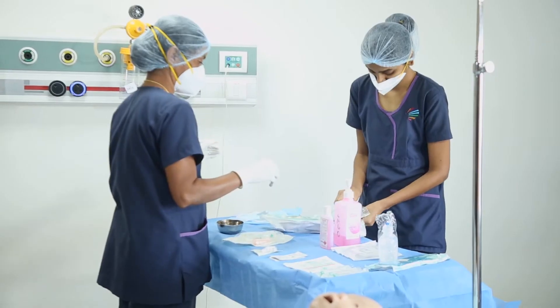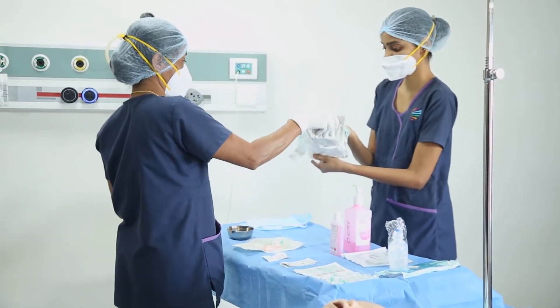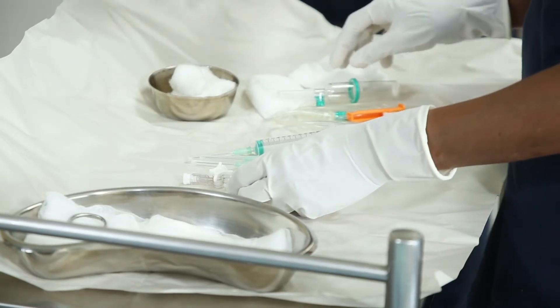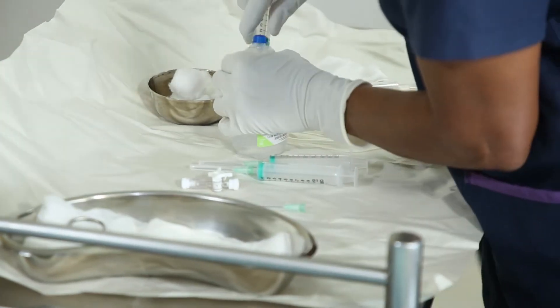She will then open the dressing set and keep the syringes and other material ready. She will prime the 3-way stopcock and the IV set with saline and load hep lock if required.